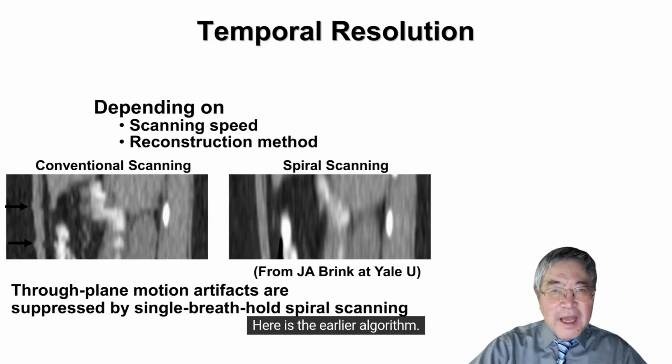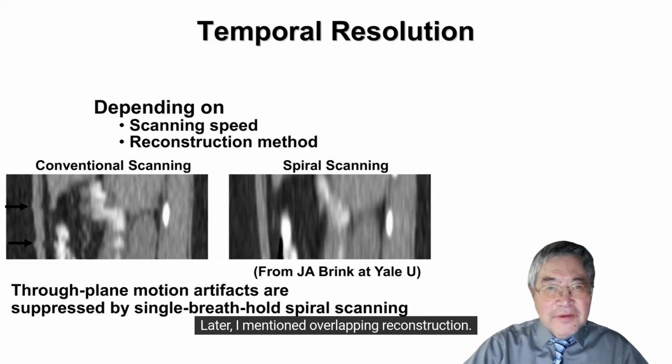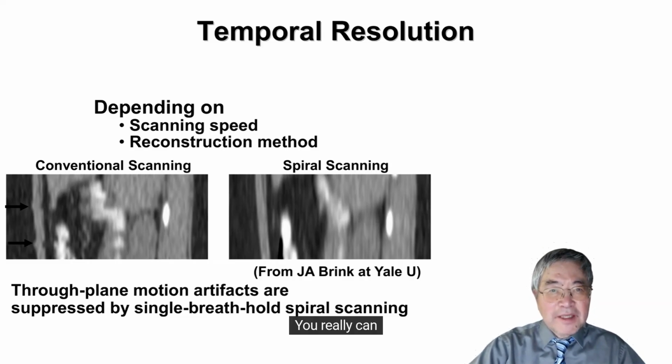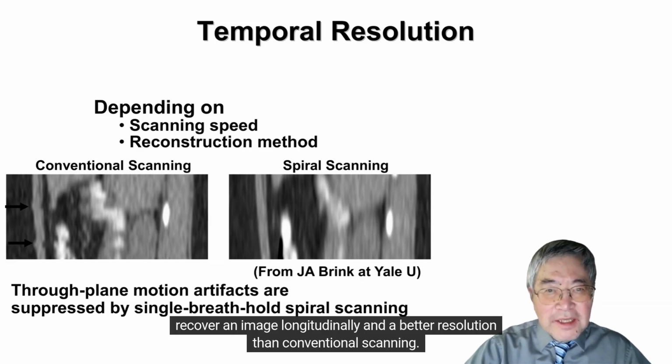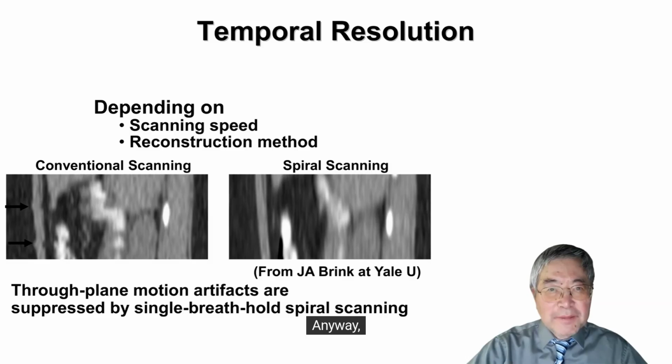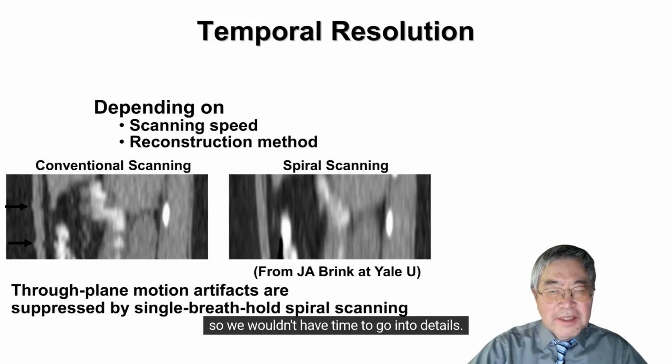Here is the earlier algorithm. Later, I mentioned overlapping reconstruction. You really can recover an image longitudinally at a better resolution than conventional scanning. Anyway, we wouldn't have time to go into details.